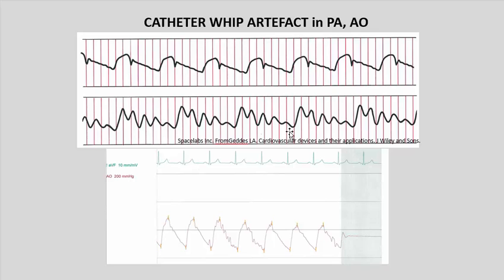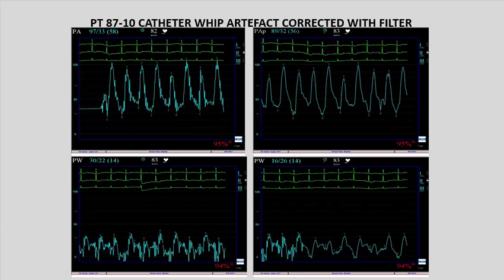They're movement artifacts. Movement of the catheter within the vessels causes an acceleration of fluid within the tube that is evident as these flicks, shown naturally in one of my own recordings. Again, aorta on a scale of 0 to 200 with the bottom bit cut off, sinus rhythm. You can see these are nice traces. You can make out the dicrotic notch, and then you get these little superimposed artifacts. That's movement. We learn to censor those in our minds, and it doesn't really affect our recordings.